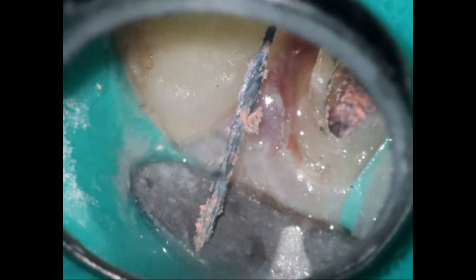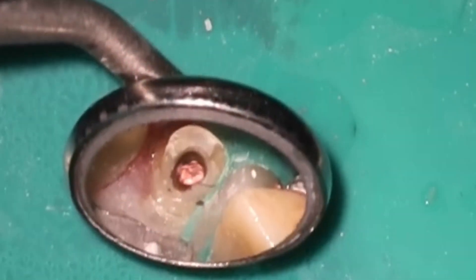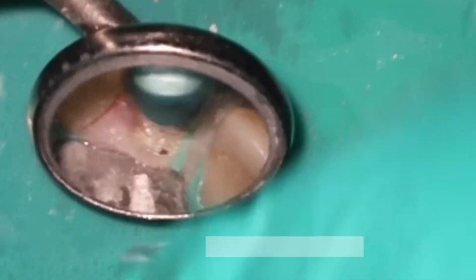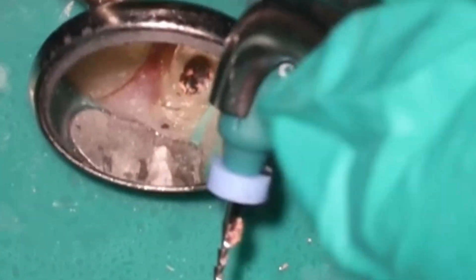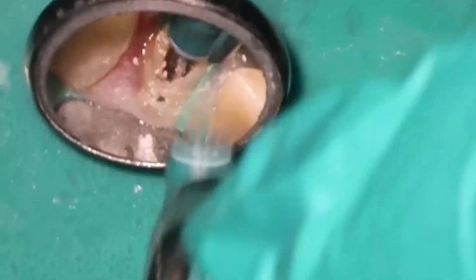So at this point, that's three things we have pulled out of this tooth, and I'm just impressed. It's actually amazing how much was inside there. So what we're doing now — new F1, spinning that at 500 to help melt the gutta percha and loosen everything up. You can see deep down inside there we have a little piece right at the apex we need to pop out. Using a 35 here to loosen it — we're pretty close to being patent. Estimated working length was 21 on the cone beam, so we're down at about 20, pulling everything out. It had kind of a big flare, and then the tip was actually pretty skinny, which is why I chose the 35.